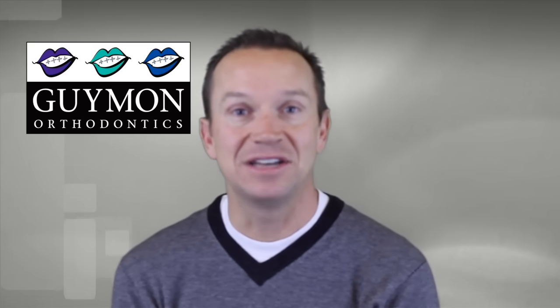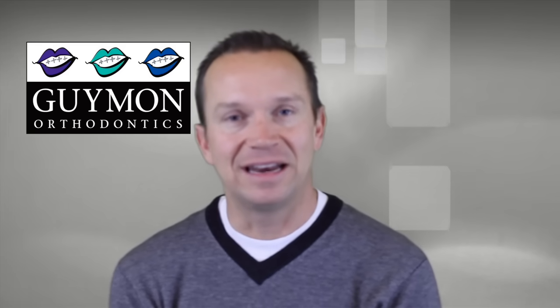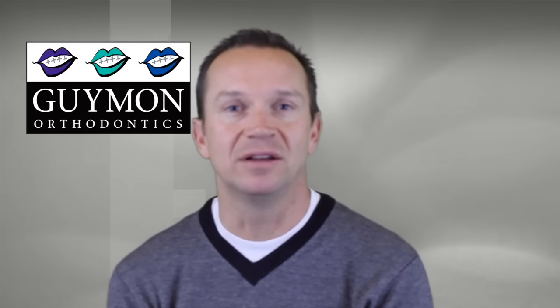We've put braces on patients as young as 6 or 7, and really it's not a hard thing to go through. Now I will say that the next couple of days after braces are a little more challenging. That's when your teeth are going to be sore. But in our office, really, there's not a lot of pain while you're at the office. Most of your tooth soreness is more of a dull soreness rather than a sharp pain, and it usually happens a day later, maybe at the earliest 4 hours after an appointment. But during the appointment itself, you can see it's pretty relaxed, pretty easy. And again, there shouldn't be a lot of worries about what's going to happen here in the office.